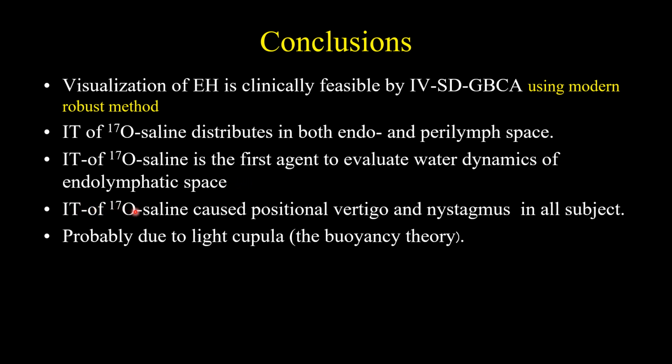Intratympanic injection of O17 saline caused positional vertigo and nystagmus in all subjects. This is probably due to the light cupula phenomenon, buoyancy theory.